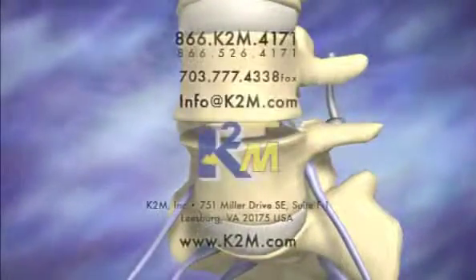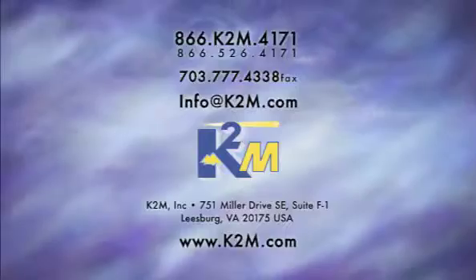The Elution Spacer System from K2M. Surgeon-driven design.